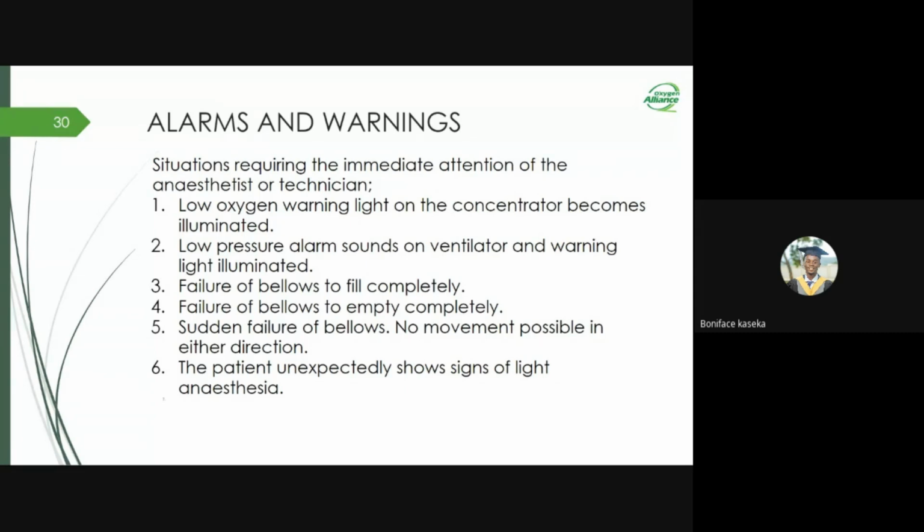Moving forward, if there is sudden failure of the bellows and there is no movement at all, many times it is a mechanical fault inside the ventilator, and we can also just turn to manual ventilation via the self-inflating bag.